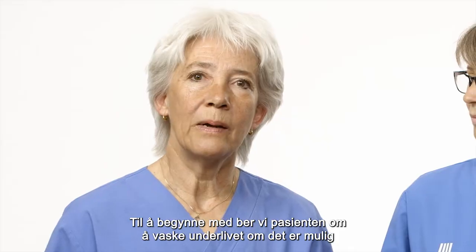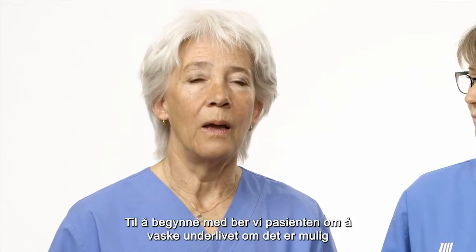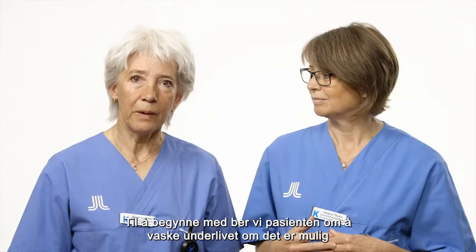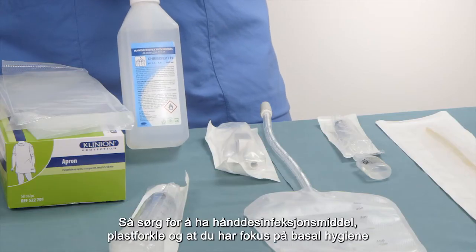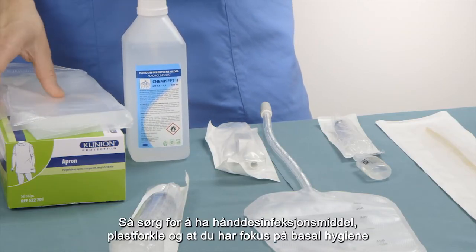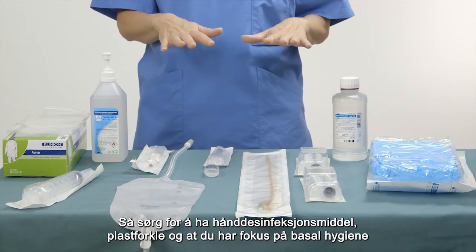To start the procedure, we ask the patient to wash their own genitals if possible. And during that time, we prepare the catheterization. It is important to consider your own hygiene, so make sure you have antiseptics at hand as well as a plastic apron, and that you apply basic hygiene procedures.